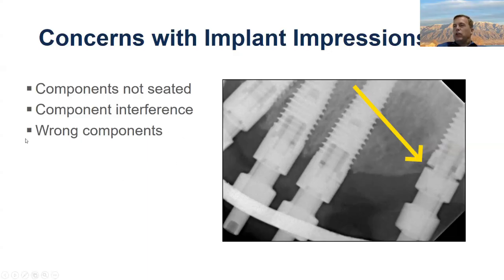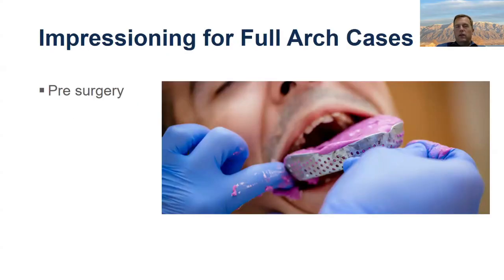Last thing is make sure you verify the components. I always recommend to offices get the report from the surgeon about the implant that was placed. And then when you order the parts, you can just say, hey, I have this lot number of implant and I need the components for it when you call the manufacturer. That way you'll be sure you get the right thing. And then, of course, if you have that report and send it along to your laboratory, that'll help make sure that we get all the right parts, analog, the abutment, all that stuff, just to keep everything running smoothly.